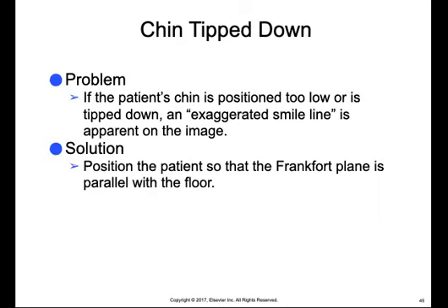Chin tipped down is a problem that happens if the patient's chin is positioned too low or is tipped down, and it gives us something that looks like an exaggerated smile line on the image. So it almost looks like a jack-o'-lantern on a pumpkin, just a really exaggerated smile.